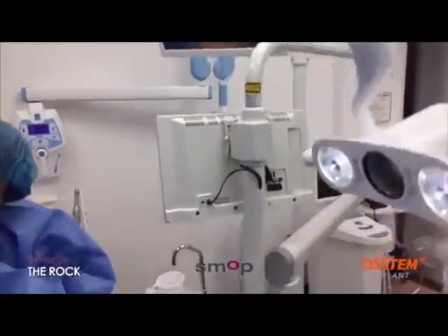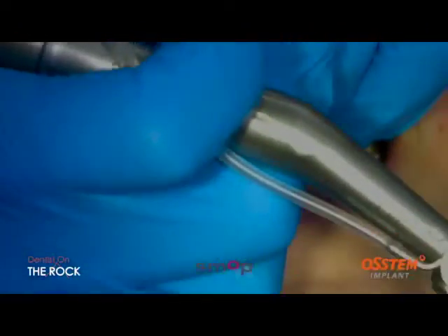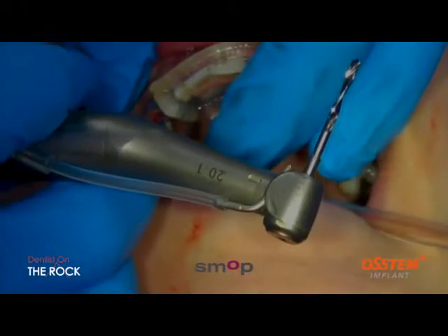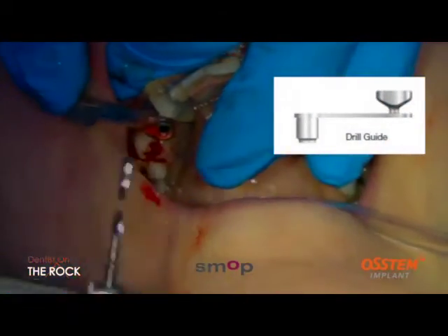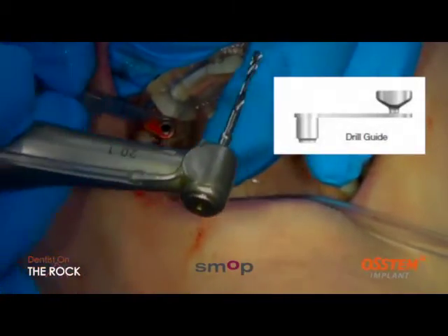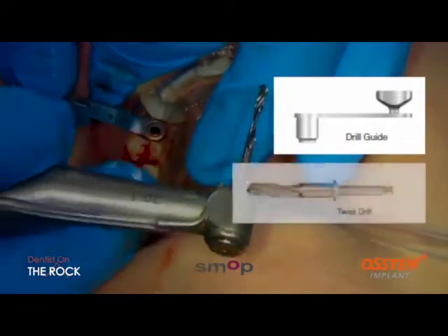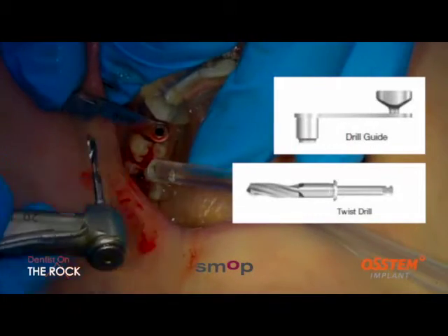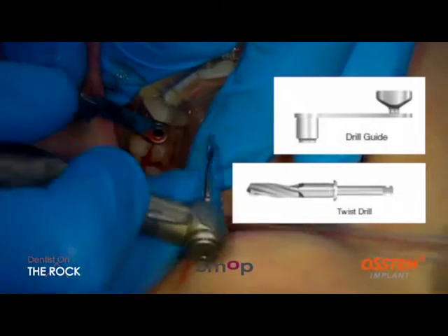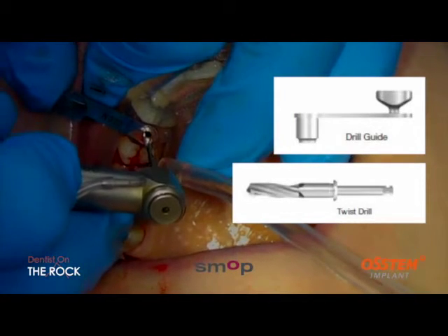So the implant that we've designed on the software, that hopefully you've had a chance now to design on SMOP in the background, is a 3.5 by 11.5. The key, you'll see, fits in really nice and snugly, forcing that in there. And then I'm going to support that with my thumb in the back part here. And if I support that, I'm going to try and prevent any vibration. Even if I try, it doesn't really move that much because it shouldn't do. It should be a nice tight fit.